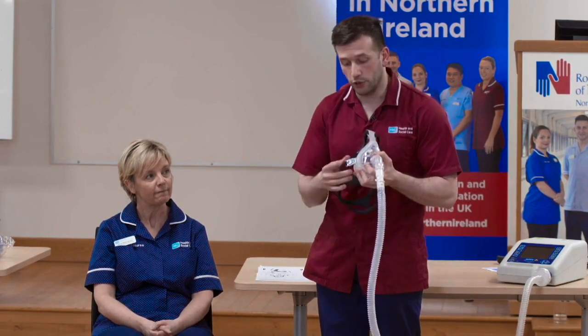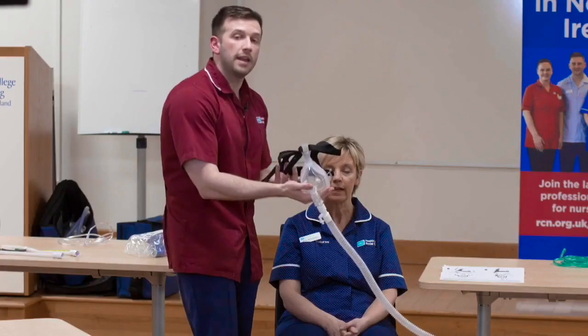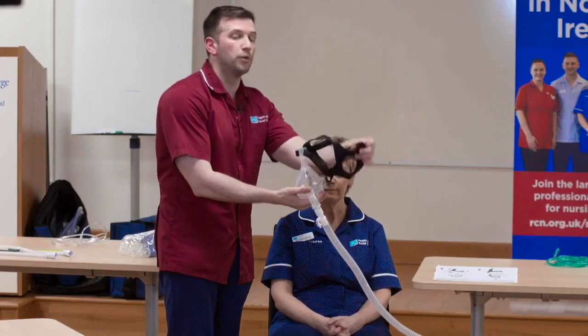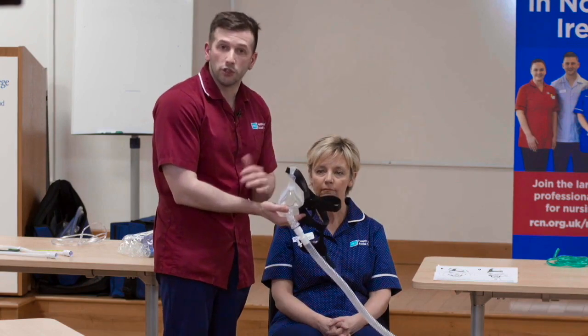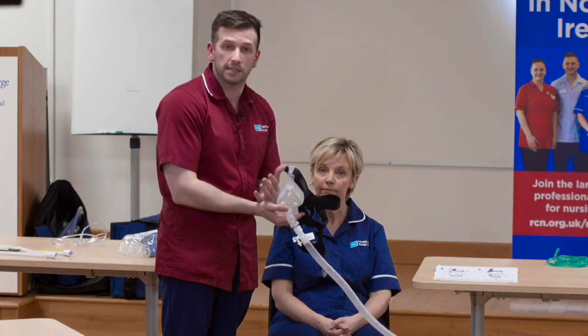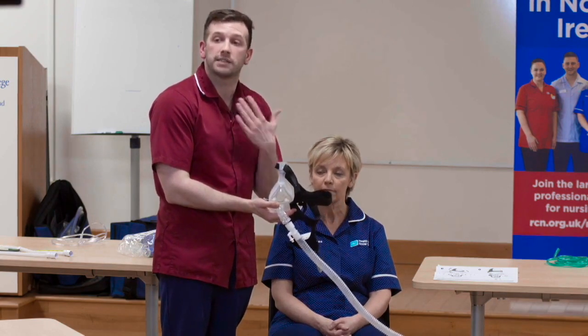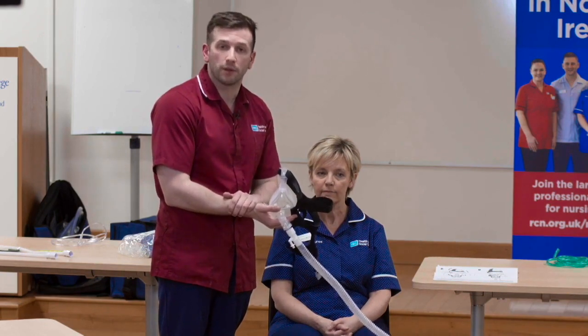The first thing I will do is I will release the buckle here on the side of the mask. Next, I will take the headgear and I will move it to the side. I will have explained to Anne-Marie the purpose in using this therapy, and I will give her reassurance and coaching as necessary in how she can try to synchronise and work with the ventilator to achieve the optimal therapeutic response.